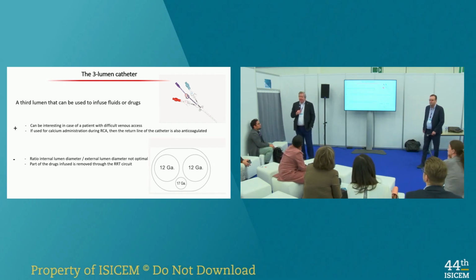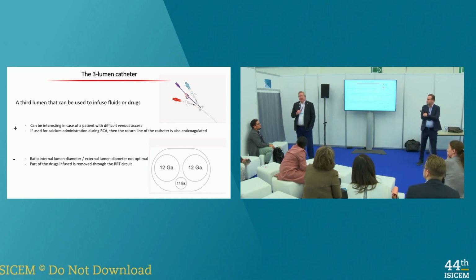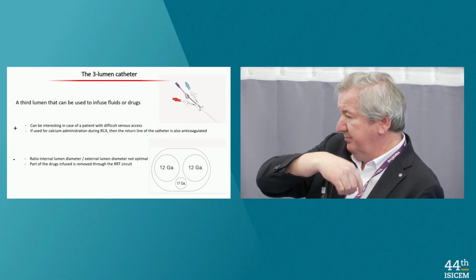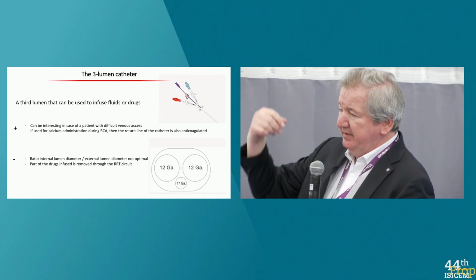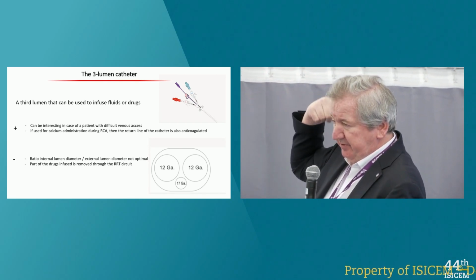This is possible. I mean, at some point, if you can make sure that your 20 centimeter in the left one, even 25, is going deeper, might be the dialysis catheter, and then you have your central line, 15 centimeter, on the right side.